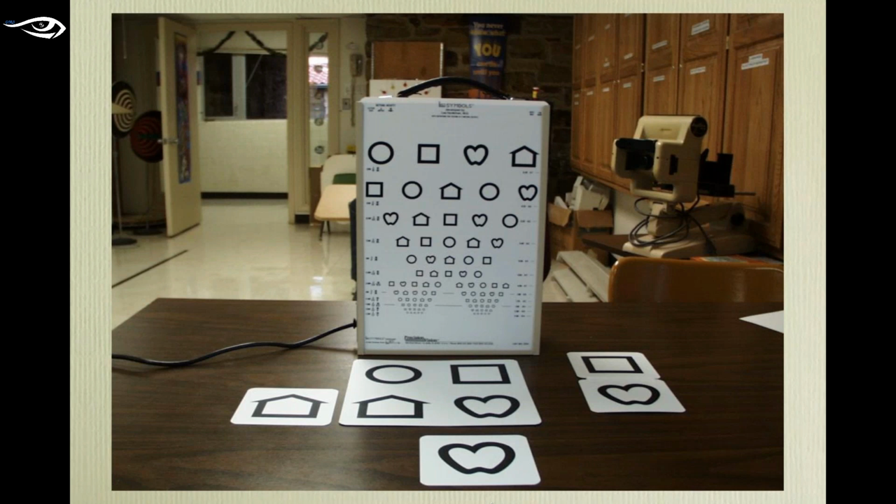And the same with the HOTV. And in general, that's pretty much how it's done in the US, either this way or not on a light box, on a computer screen. And for research purposes, that actually is what's used pretty universally in the US nowadays, is the HOTV on a computer screen with a particular automated paradigm going forward and a scoring system with a rapid staircase. I'm not going to go into too much more detail on that.